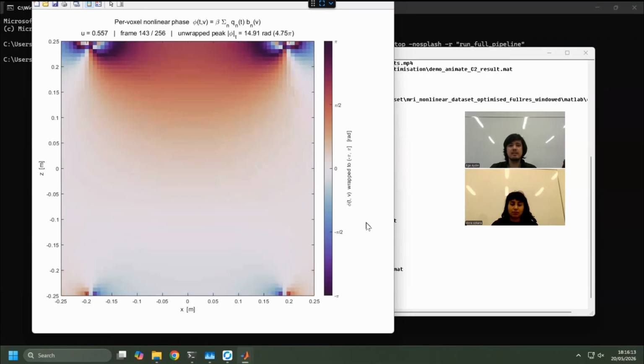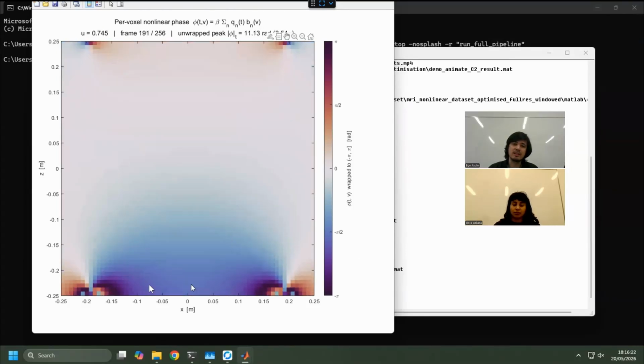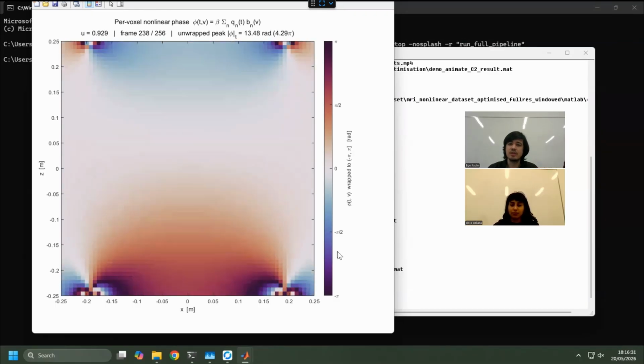So you can see that it is using the nonlinearity of each coil to its maximum potential because it's running, for example, this one forward, this one back, and it changes them and it runs them both at the same sign, for example.